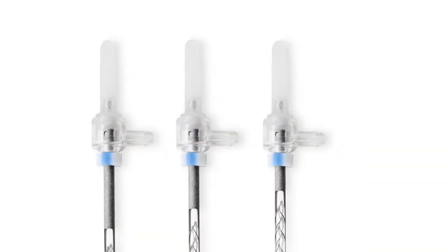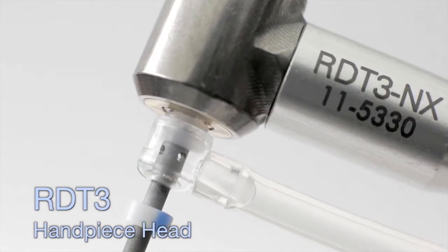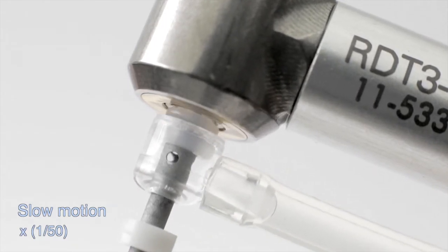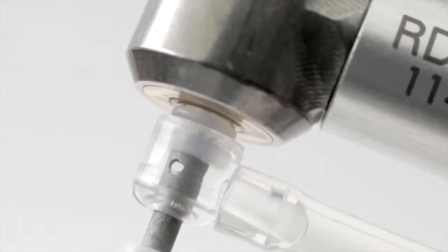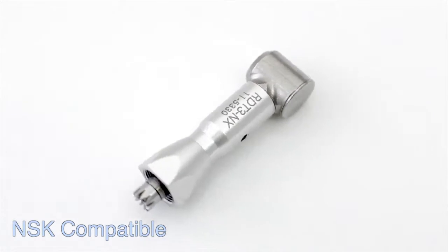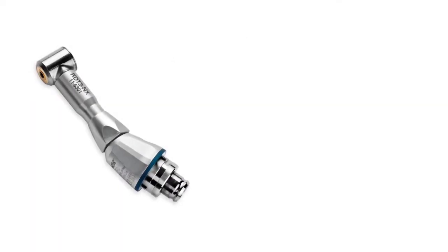The SAF is available in three standard lengths and two different diameters. The patented RD-T3 handpiece head delivers sonic speed vertical vibrations combined with slow, low-torque rotation. Dentin is removed by grinding the file in a rapid in-and-out movement to ensure dentin removal is uniform circumferentially. The RD-T3 head is available in two configurations, making it compatible with a variety of contra-angle handpieces and motors.